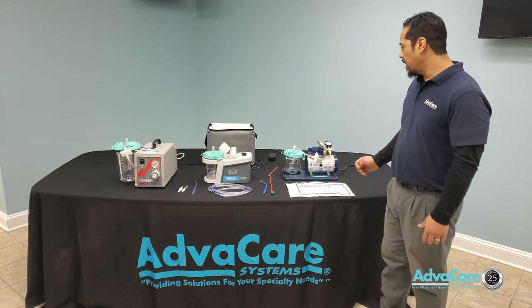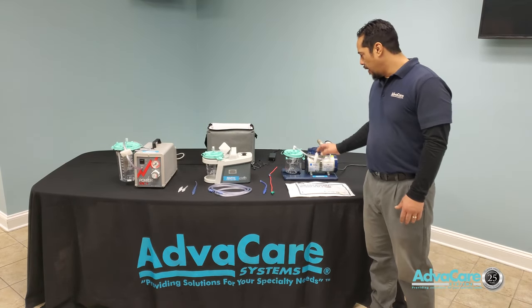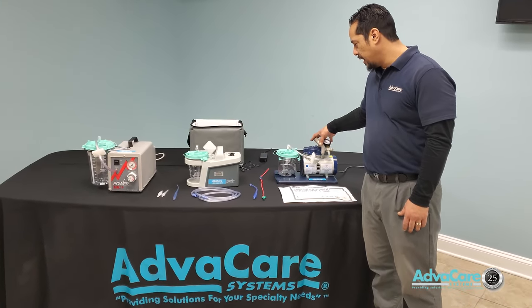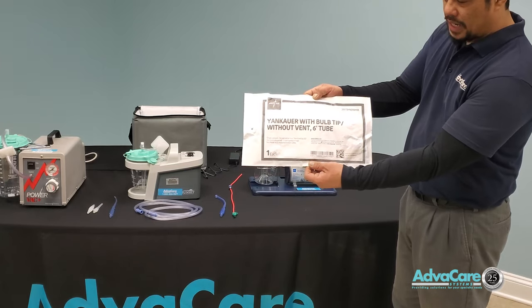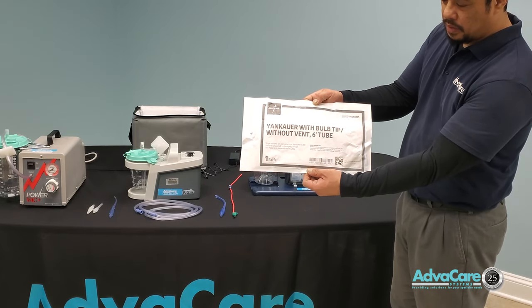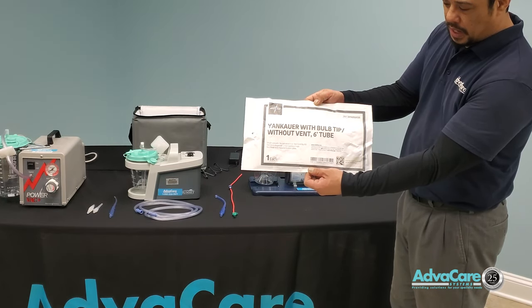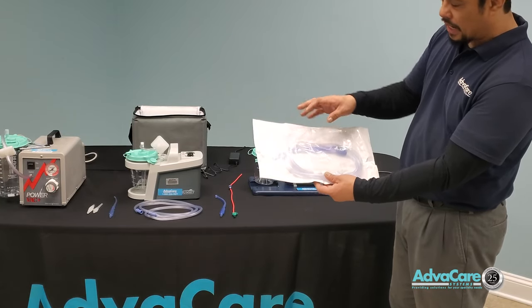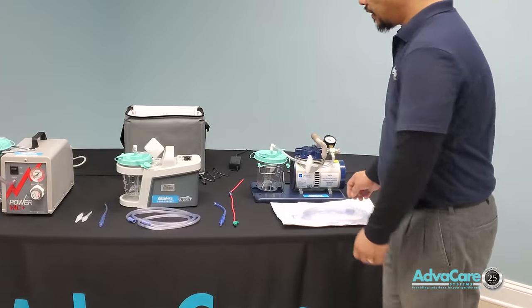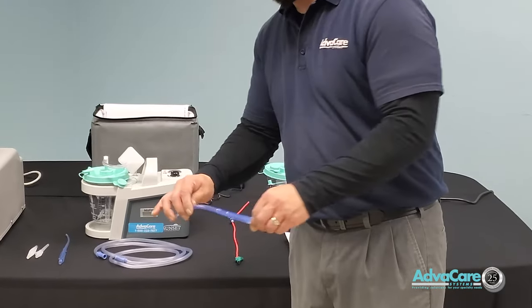Every time we deliver a suction machine it will always be delivered with the machine itself. It will be delivered with what we call a Yankauer with ball tip and vent tube and six-foot tube. This tubing and the Yankauer in the plastic package will be representative of this large hard plastic Yankauer with ball tip.